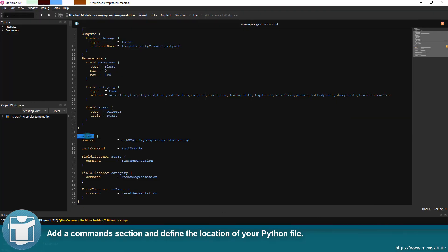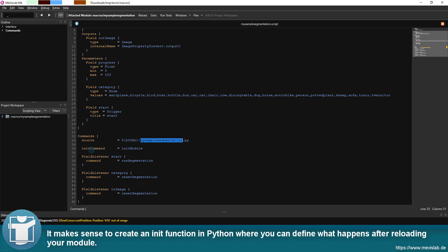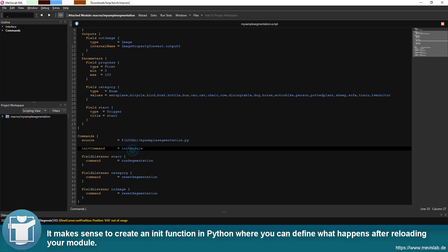Add a command section and define the location of your Python file. It makes sense to create an init function in Python where you can define what happens after reloading your module.